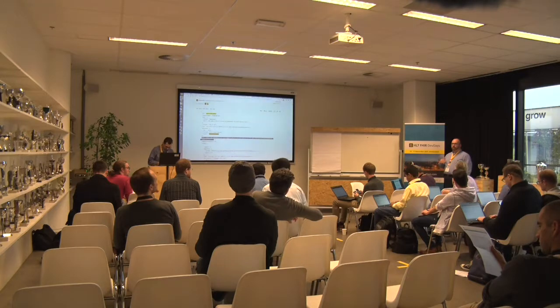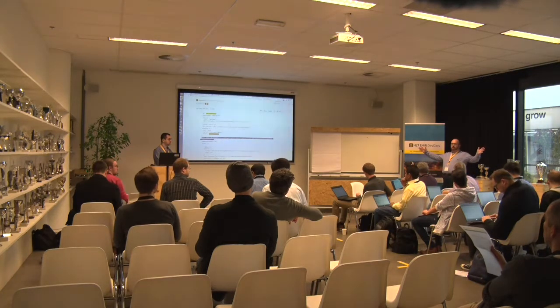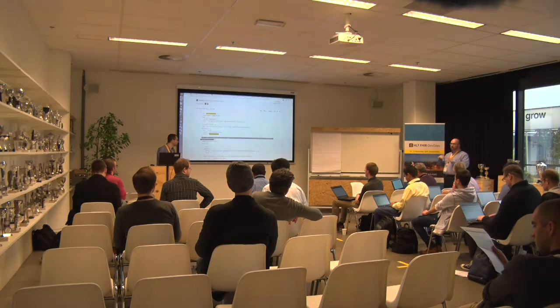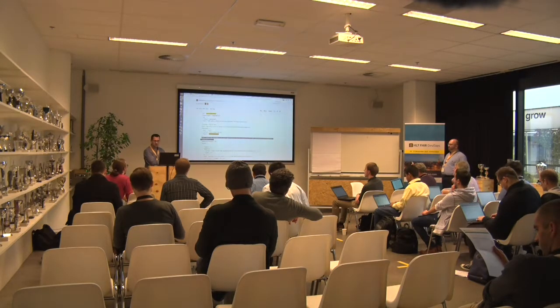If you think about it, we had URLs at the study, series and instance level. If you had a 10,000 slice CT study, you would have 10,000 gargantuan URLs. And if you're just wanting study discovery, that's 90% of what you get back. So we got rid of all of that and just used endpoint to say, here's where the server is. You can construct your own URLs depending on what your needs actually are. So that's why we have to work on that. I'll have to fix that. Yeah, so good, okay, I've got homework.